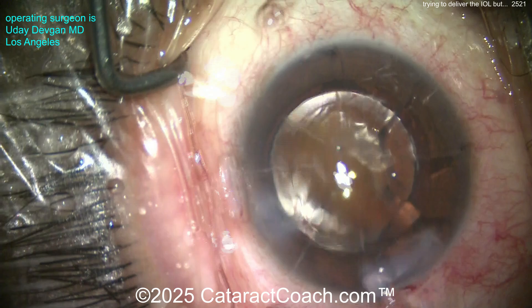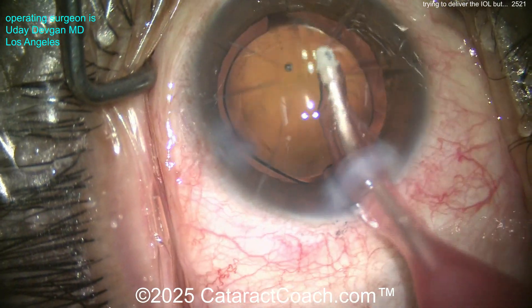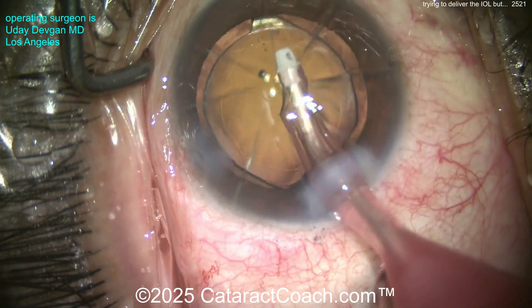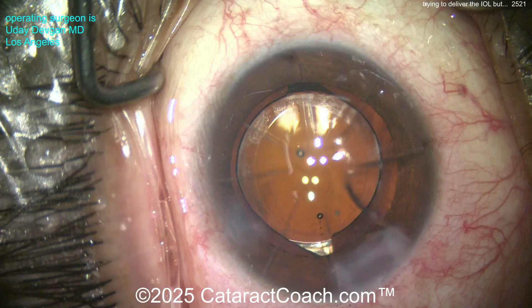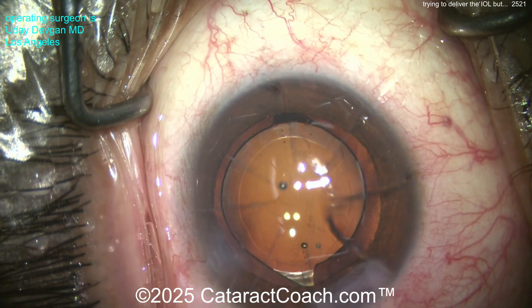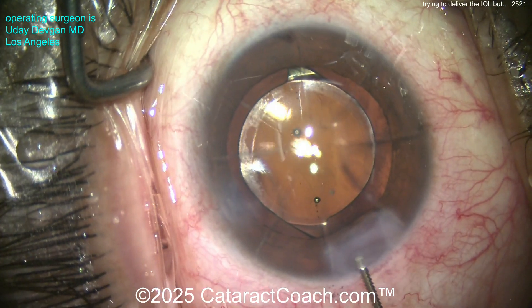There's a little viscoelastic stuck in the angle — we'll wash all that out of the eye. There's also a little piece of lens material we'll want to get out. Get that irrigation probe back in the eye one more time to clean this out. Remember, these are things that can happen in cataract surgery — they can happen to you and they can certainly happen to me. That's why we learn together with Cataract Coach videos.